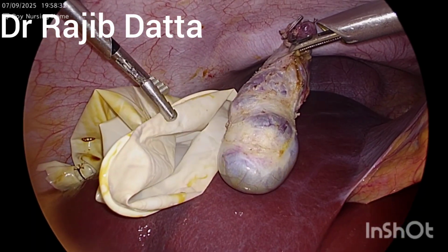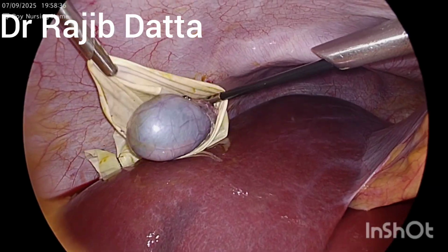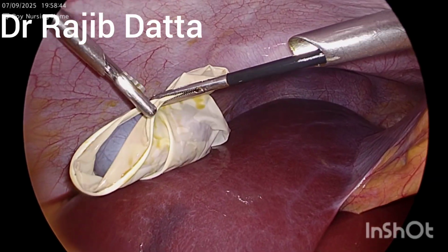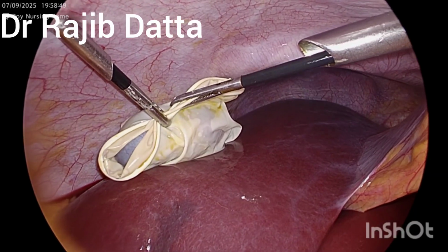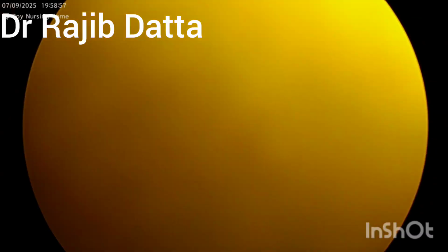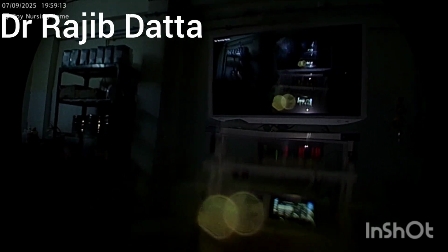There is less chance of glaring effect. In a transparent bag there are light reflections and it creates some glaring or visual problems. So I prefer to use this white endo bag, or gloves as an endo bag, soaked with betadine. It will absorb the light and there will be less reflection.